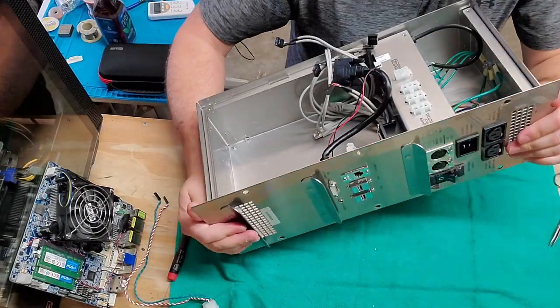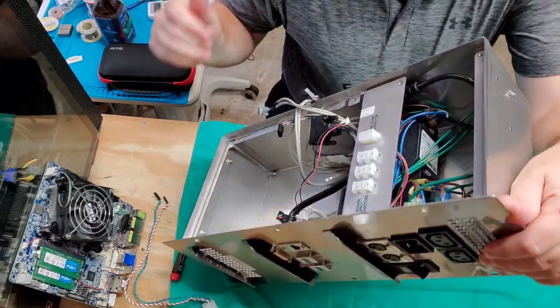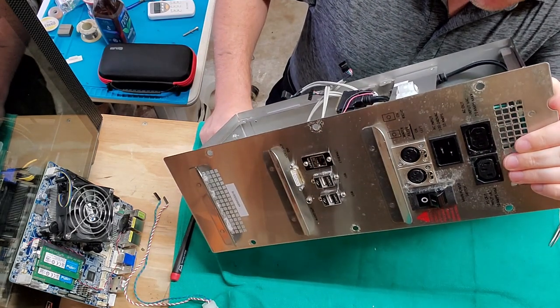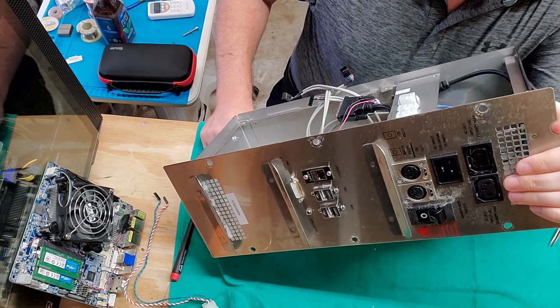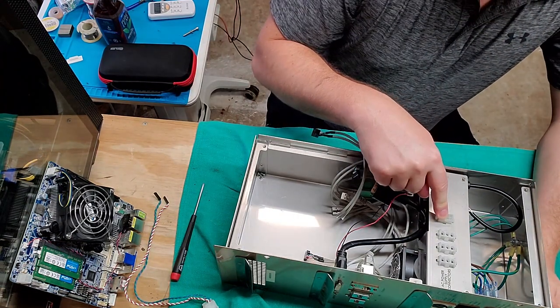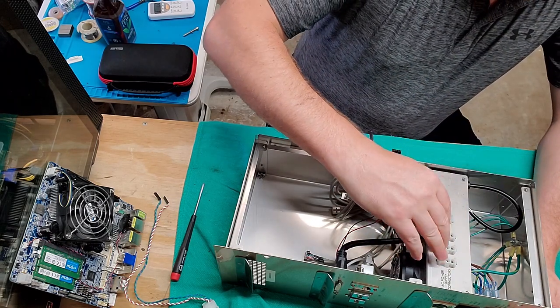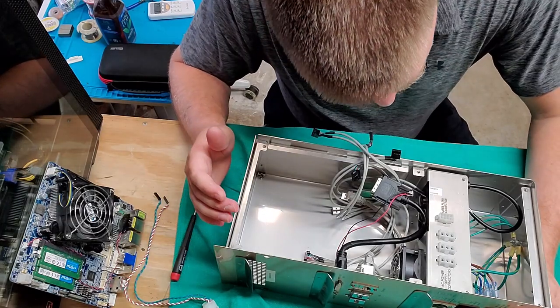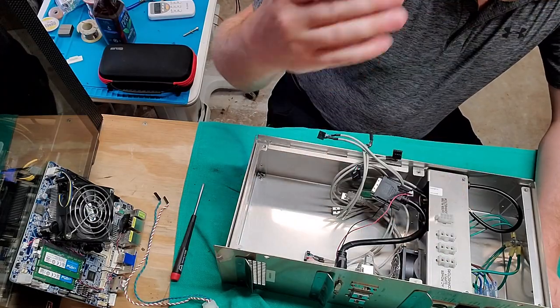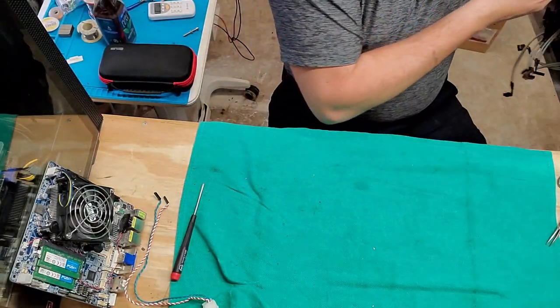All right, and I see that there's a large contactor in here. See that right there? So there is a contactor inside the case. That's peculiar. All right, we'll have to figure that out. That's probably when the machine itself turns on. You can see AC power supply connector. So that guy probably connects, maybe from the PC, it turns it on. I don't know. I'll check that later. But that contactor kicks over, boots up the rest of the device. So that's the case. Let's take a look at this motherboard.